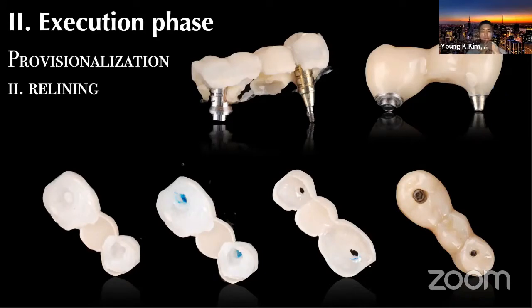Because you do all those wax ups and make a temp shell and reline it, and later you have a discrepancy, a little angular discrepancy. All of a sudden you have interferences. There's no meaning to the wax up. I would have just done the block temp, right? So a temp shell with a specific repeatable reinserting pathway is critical.